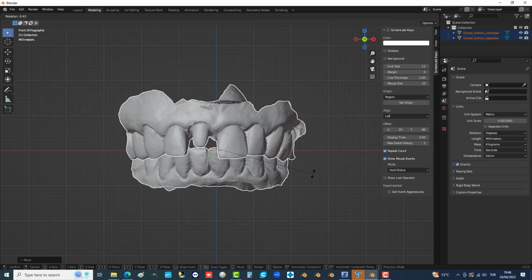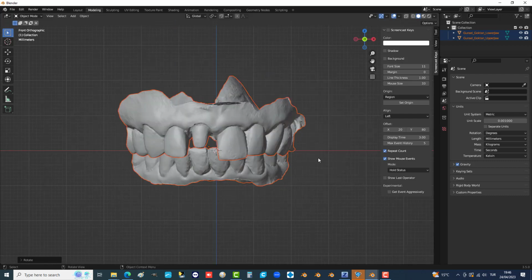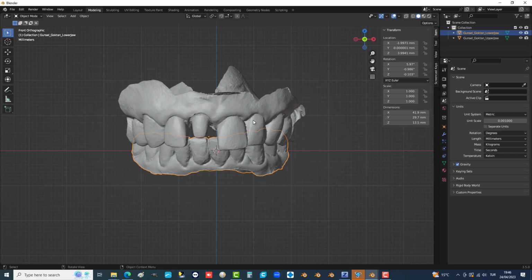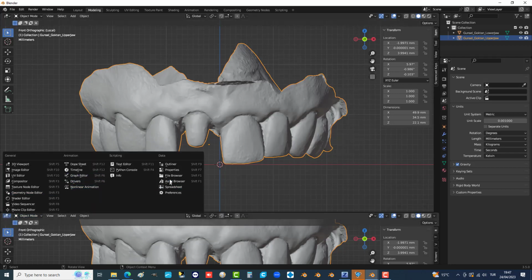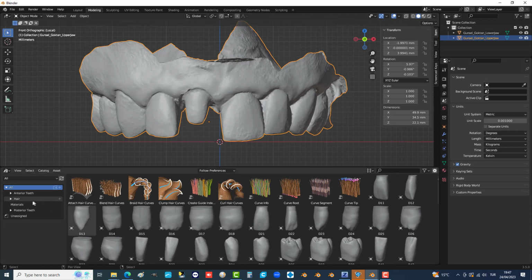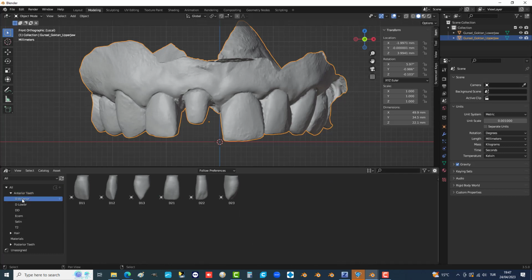and patient satisfaction. Blender software allows for precise and accurate 3D modeling of the temporary crown, ensuring a perfect fit. Designing a temporary crown with Blender software can be much faster than traditional methods such as manual sculpting or using a physical mold. This can save valuable time for both the dentist and the patient.